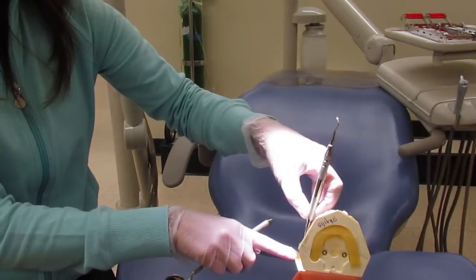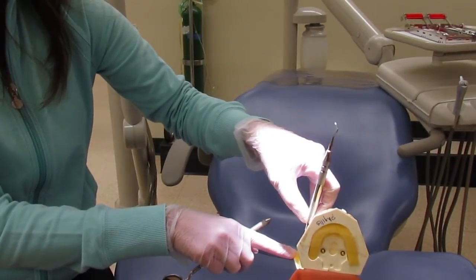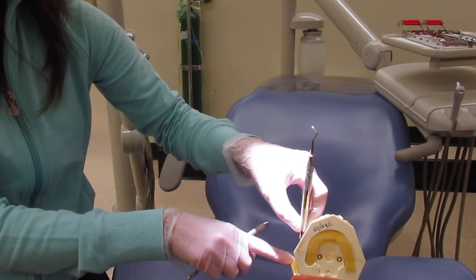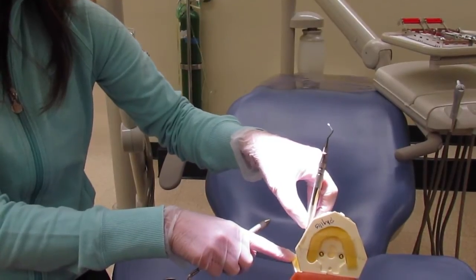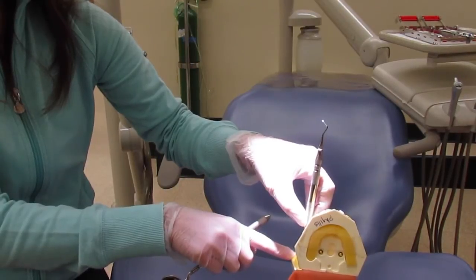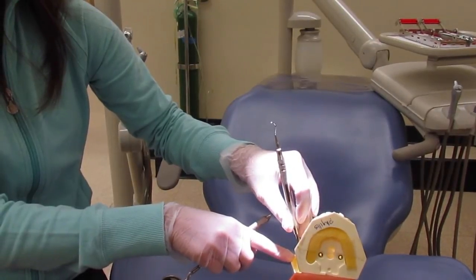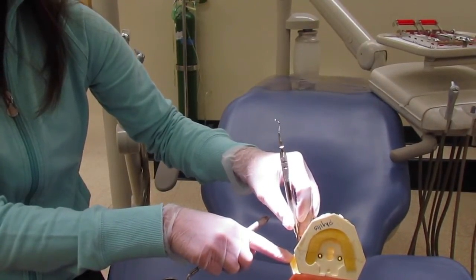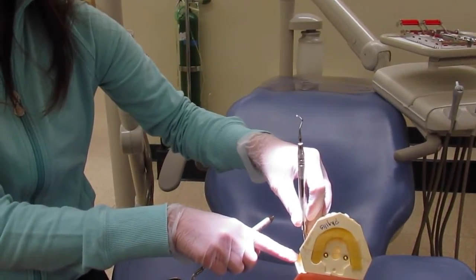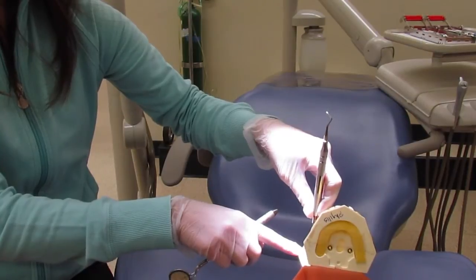This is the UC curette again on the buccal of number 18. Starting at the distal line angle, we'll go ahead and activate short controlled overlapping strokes going into the distal, making sure to keep the terminal shank upright. Then going halfway into the distal, we'll stop and come back out, and then back at that distal line angle to go mesially — short oblique strokes going mesially — then pivoting and rolling to go into the mesial contact.